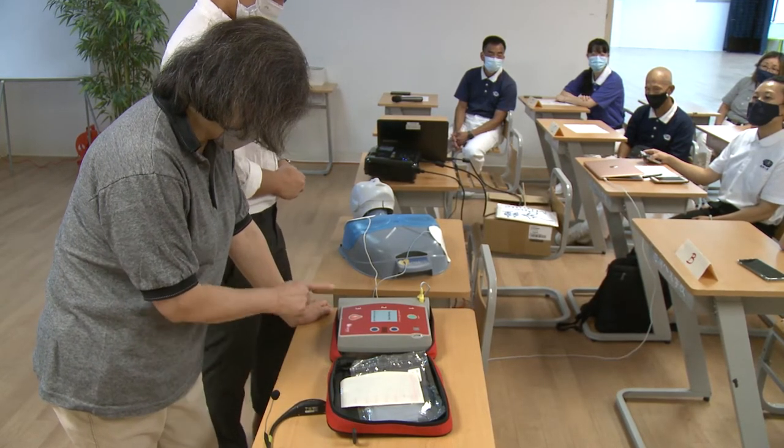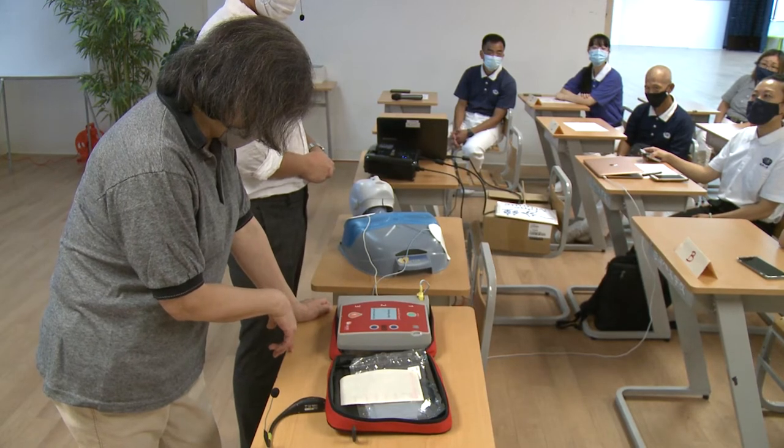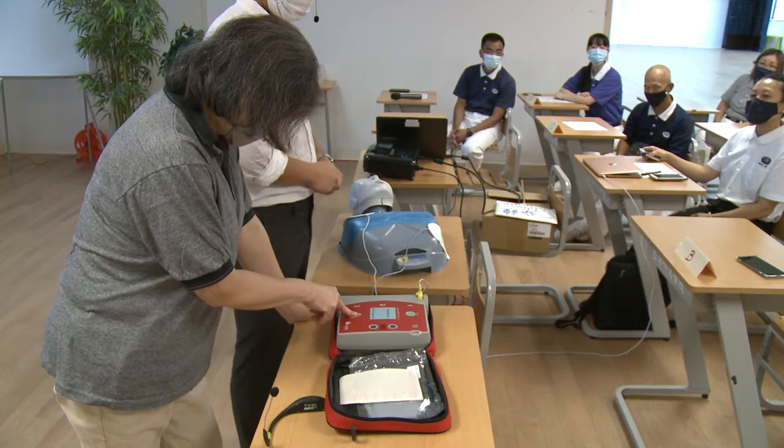Shock advised. Charging. Everybody clear? Stay clear of patient. Clear. Deliver shock now. Shock delivered.